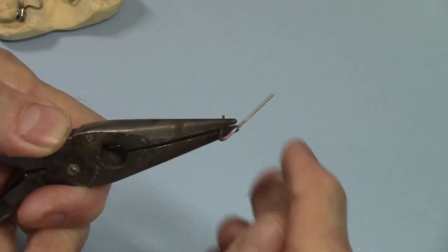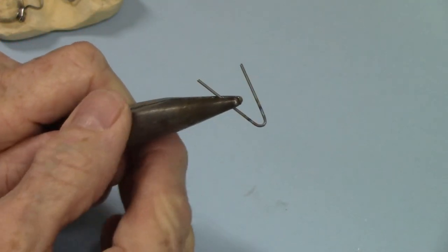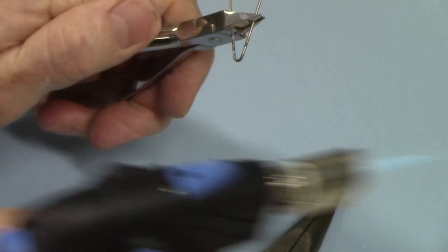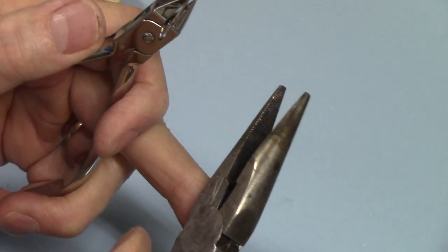I'm going to heat it up and then just take my finger and push it down some — that'll get it down to there. Now I'm going to hold it with another pair of pliers, and I'm using this pair of pliers I got from a hardware store.